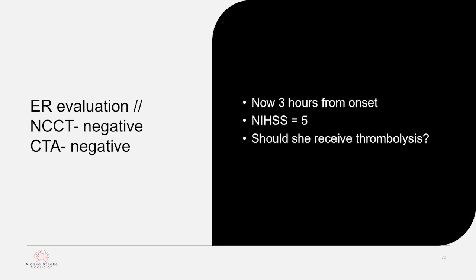And I'd like to go back here to our panels also. Please jump in. I don't know, Dr. Latta, what would you think? Should this patient be considered for thrombolysis? Well, please go ahead. I can jump in.